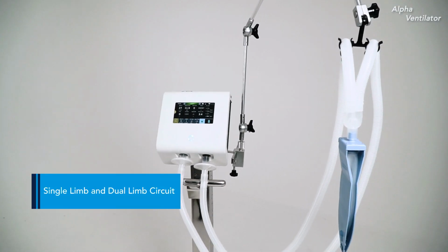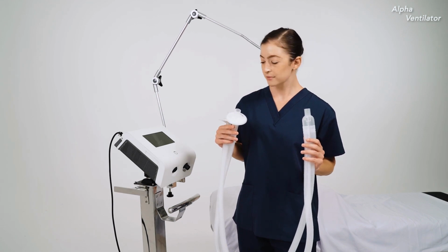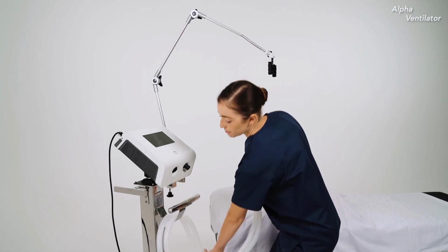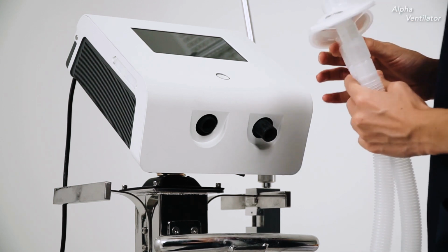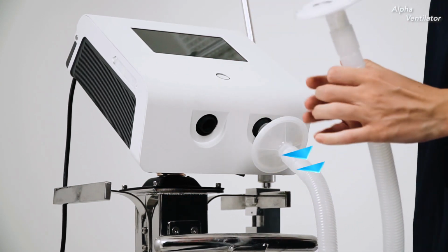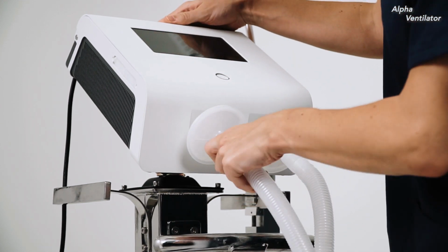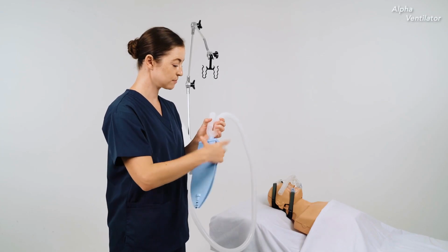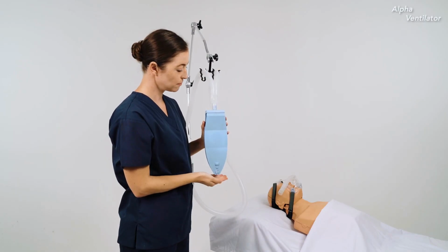The Alpha ventilator supports both single-limb or dual-limb circuits. For this demonstration, we will be using a dual-limb circuit configuration. Facing the ventilator, the port on the right is the inhale port. The port on the left is the exhale port. Connect the patient port to the test lung and program the ventilation settings before connecting to the ET tube or patient interface.